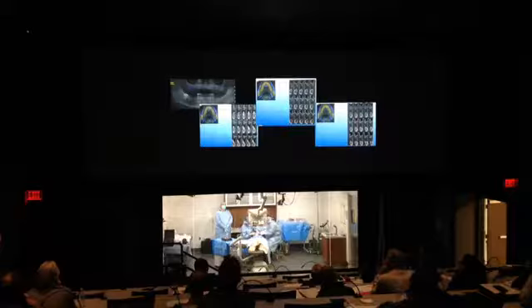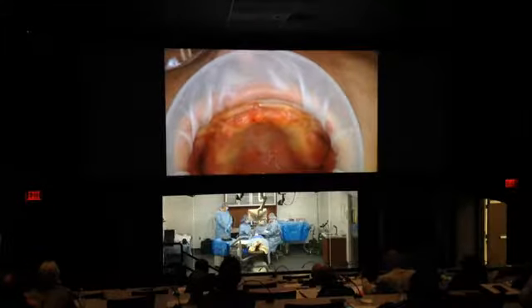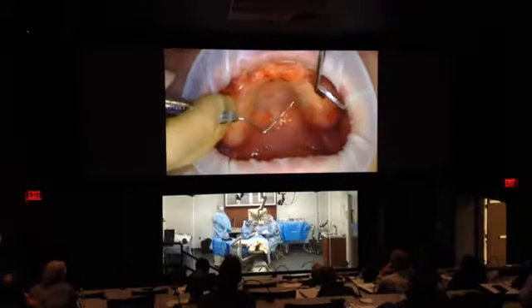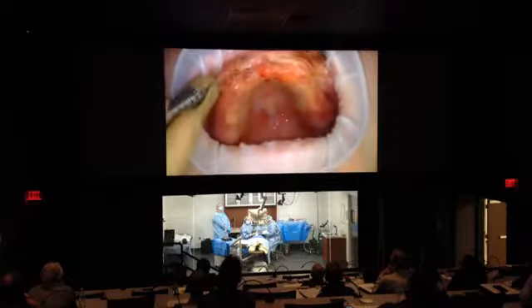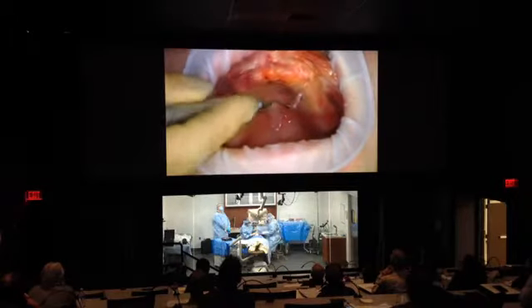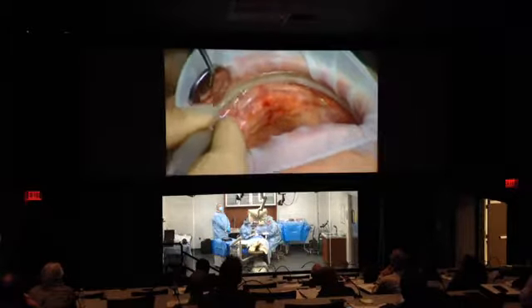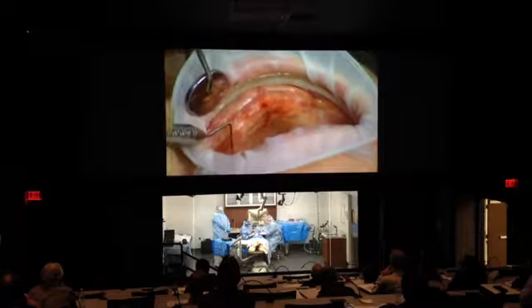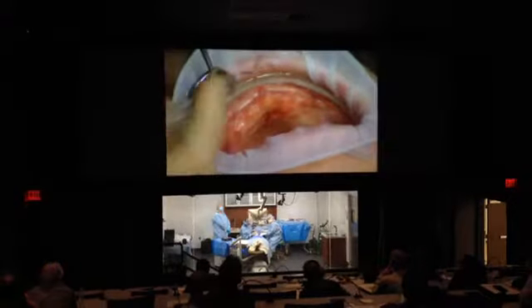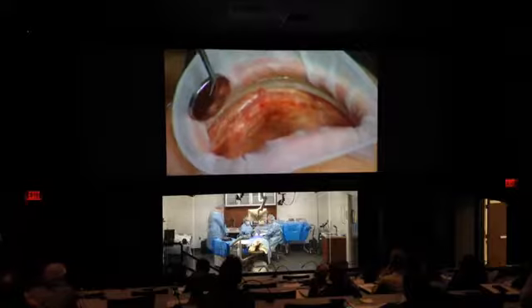So let's look here intraorally. She lost her teeth a couple of years ago. Probe and mirror, please. And she's been wearing a denture since. And if you notice here, her tissues, because of wearing the denture, have become quite fibrotic. And you actually see this epulis right here. Sometimes this kind of ridge can create a problem when reflecting because it's very fibrotic and it's easy to tear this kind of flap. So overall, though, I'm looking at the quality of her keratinized tissue, and I do like that. She has nice, thick tissue, which is required for long-term success of any dental implant therapy.